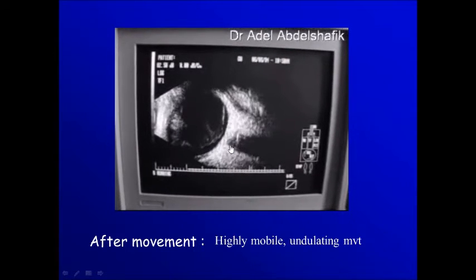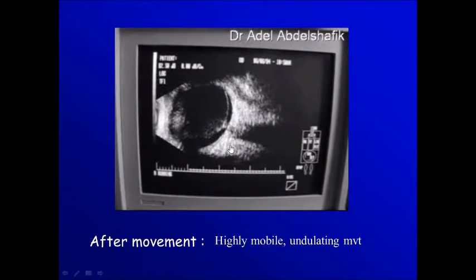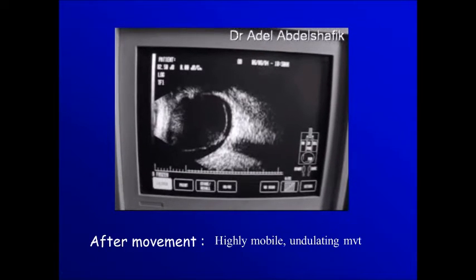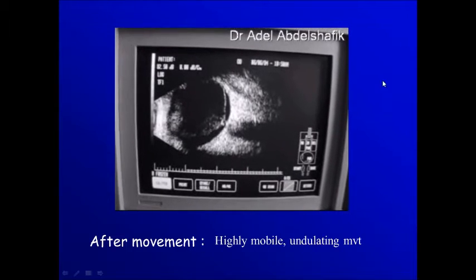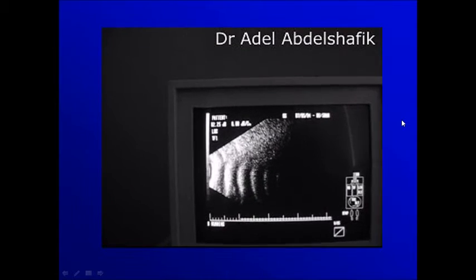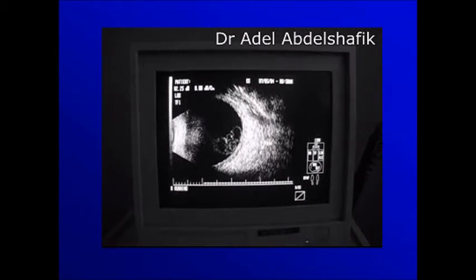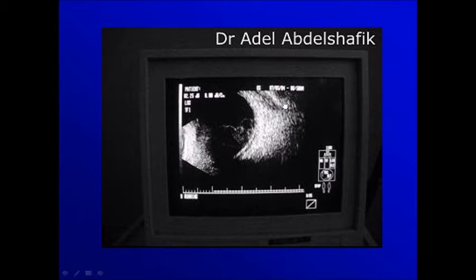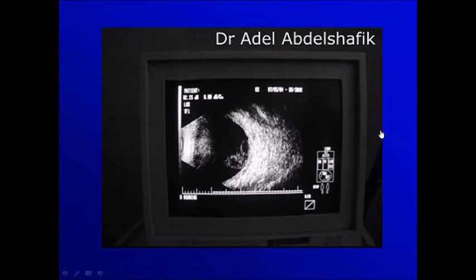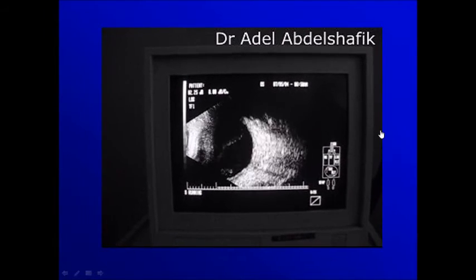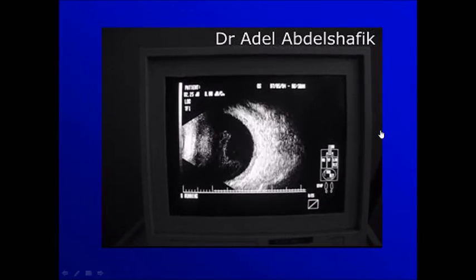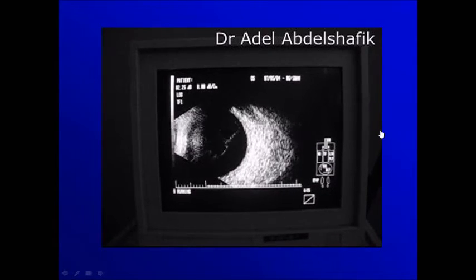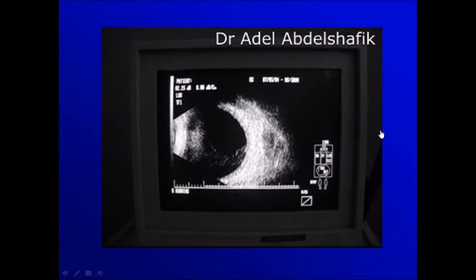You notice the movement — the after-movement of the vitreous. And this is another example. This is the choroid and retina, this is the muscle. You notice the movement, the after-movement of the vitreous.